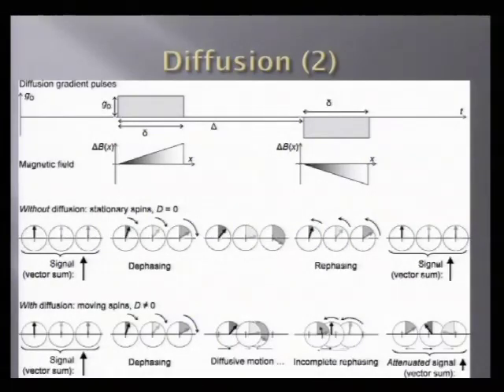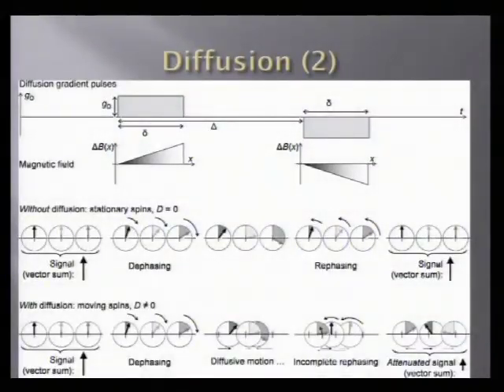diffusion-weighted imaging is hot in the literature, whether it be urology literature, radiation oncology literature, or radiology literature. Everybody's talking about diffusion-weighted imaging and ADC maps and actually trying to quantitatively analyze whether something is likely to be cancer or not. What diffusion-weighted imaging is, is that you give a really long gradient in one direction, flip that gradient, give it in the other direction, and something that moves very minimally in space will no longer give back signal because it's moved. And the computer only predictably understands what it predicts should be the precessional frequency. So it's assuming things aren't moving. So if you purposely try to create these gradients, anything that moves a little bit will not give back signal. That's called diffusion-weighted imaging.